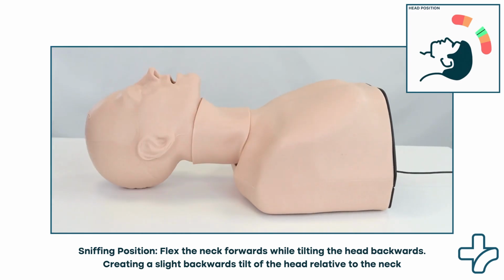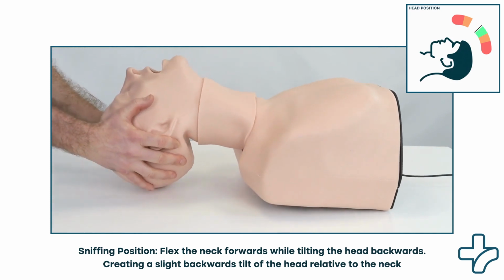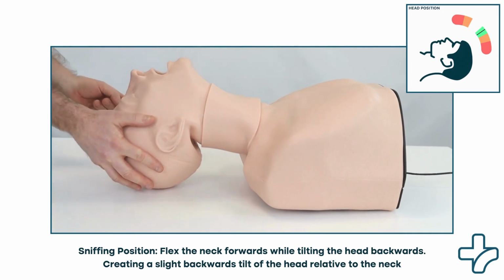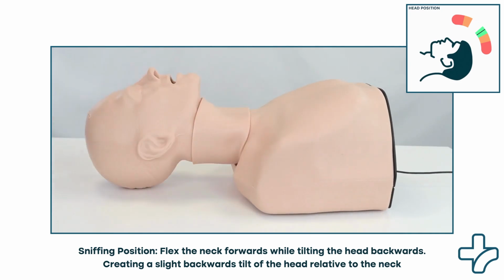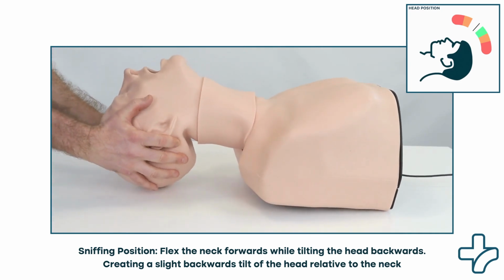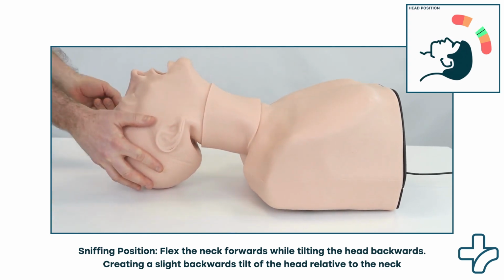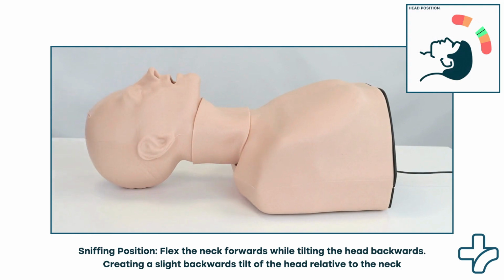In the sniffing position, attempt to lift the ear's external auditory meatus to the level of the sternal notch to align the oral, pharyngeal, and laryngeal axis. This alignment facilitates direct visualization of the vocal cords and improves intubation success rates. A useful aide-memoire is ear to sternal notch.